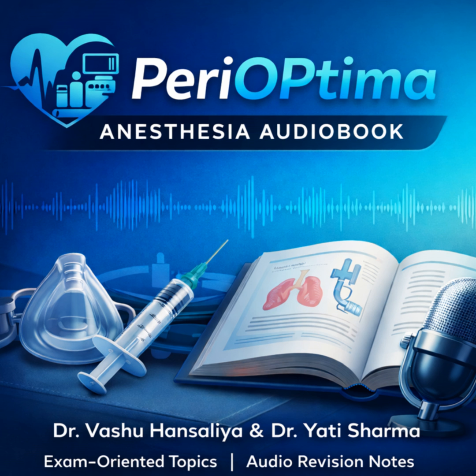Finally, for a safe answer, we have to confirm placement. What are the required indicators? You need a checklist. 1. Auscultation. Check for bilateral lung sounds. 2. Chest excursion. Observe bilateral chest rise. 3. Gastric insufflation. Make sure there's no obvious air entry into the stomach. And 4. Capnography. This is the essential, non-negotiable confirmation.